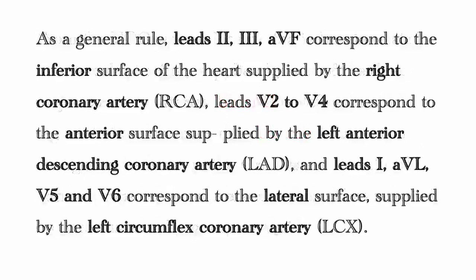As a general rule, leads II, III, aVF correspond to the inferior surface of the heart supplied by the right coronary artery (RCA). Leads V2 to V4 correspond to the anterior surface supplied by the left anterior descending coronary artery (LAD), and leads I, aVL, V5 and V6 correspond to the lateral surface supplied by the left circumflex coronary artery (LCX).